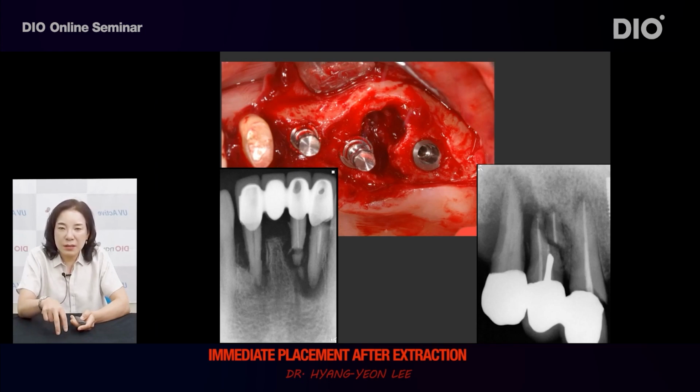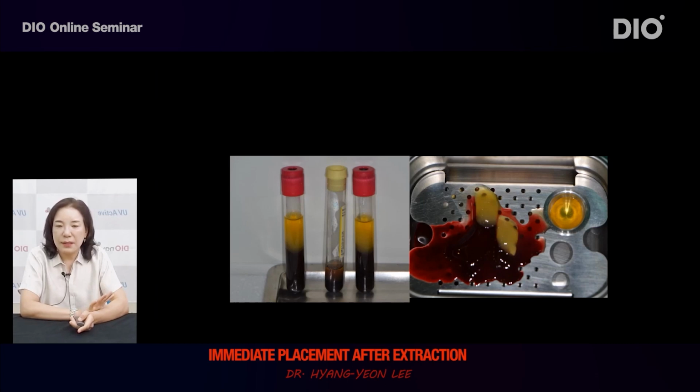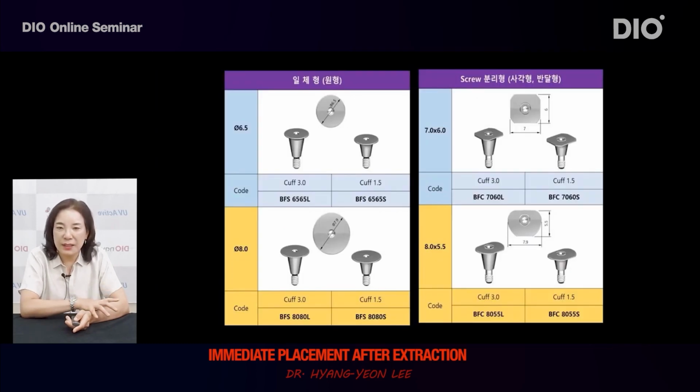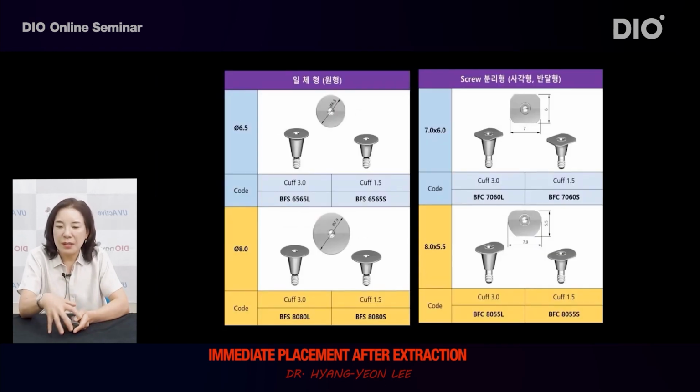If very large tooth or tooth with severe inflammation is extracted, there exists a large gap between the implant and tooth extraction socket. Producing PRF by collecting autologous blood through the use of centrifugation will be very useful in covering the shortage in soft tissues. It is also possible to cover the inadequate soft tissues by using healing abutment if the size of the area is small and bone-forming screw if the size of the area is large.